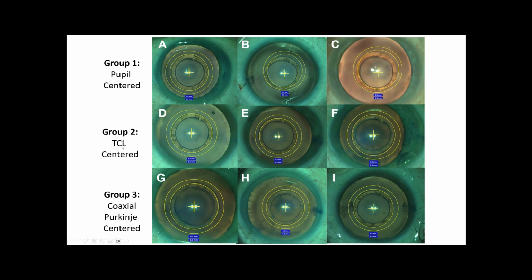Now, looking at the Trypan capsular landmark group, we see excellent consistency with the capsulotomy actually being centered on the visual axis and 5 millimeters being achieved. And this is what we're seeing with the IOL body too. It's nicely spaced around here, allowing for some deviation. Indeed, here we have slight deviation, very minor. I think we'd all be happy if we had that as well.